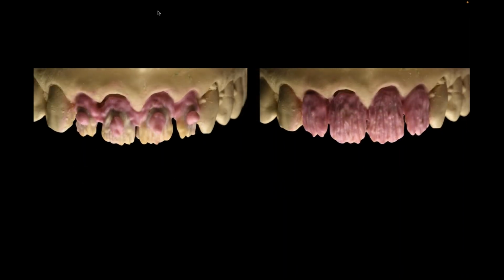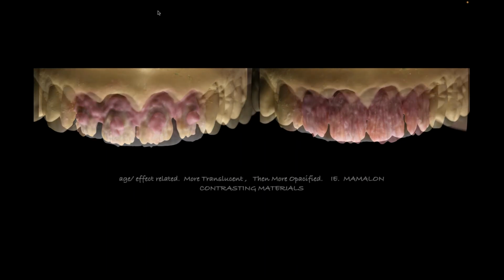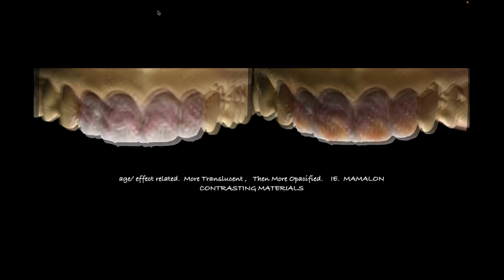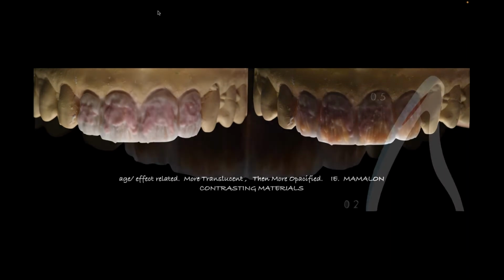At that point, I'm going to follow that with my dentin material. So I'm going to brighten up that middle third of my dentin, and then I'm going to start creating my canvas or my window with my translucent blue type materials. My mamelon materials will go over that. Those are my floating colors. And then at the end, I'm going to start covering that with my enamels.